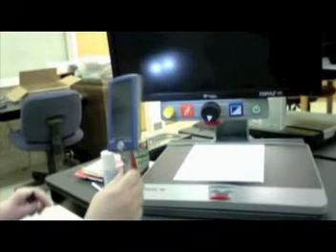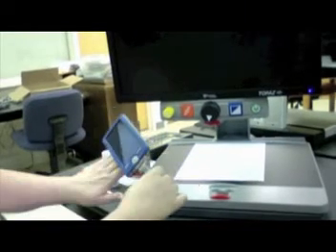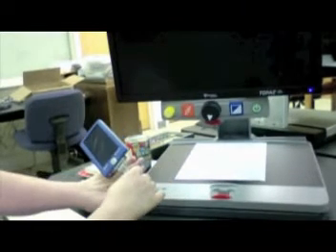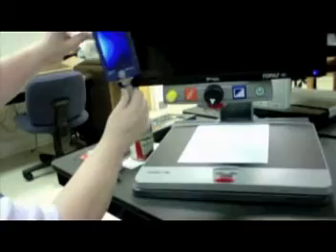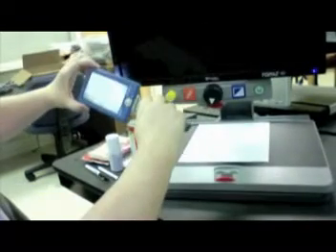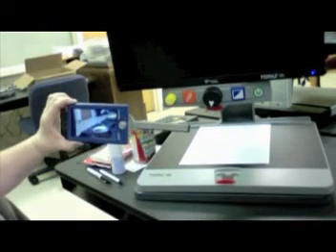Okay, this is a portable video magnifier. It does the same thing, whatever you put under the camera. The biggest trick here is making sure you know where the camera's pointed. You see it, but as you can tell, it's a much smaller viewing area.